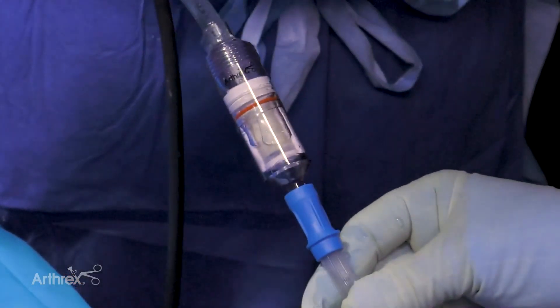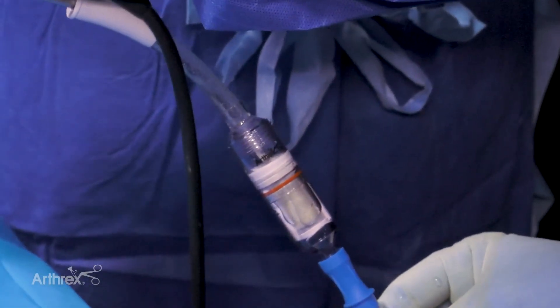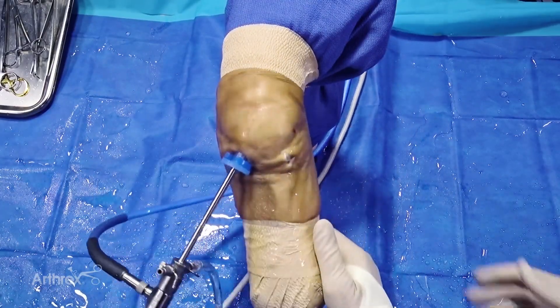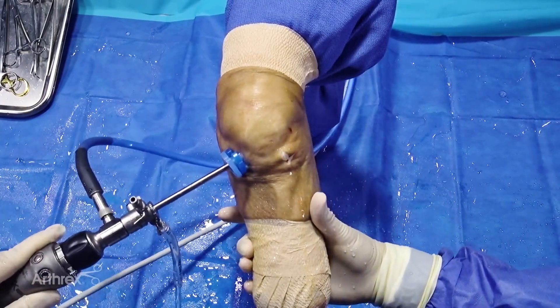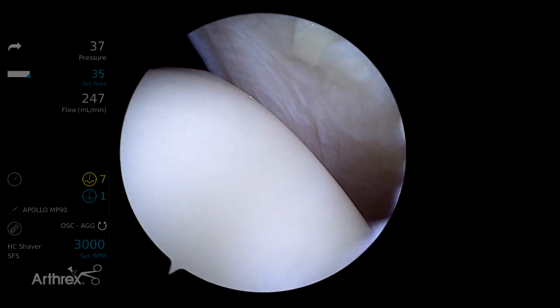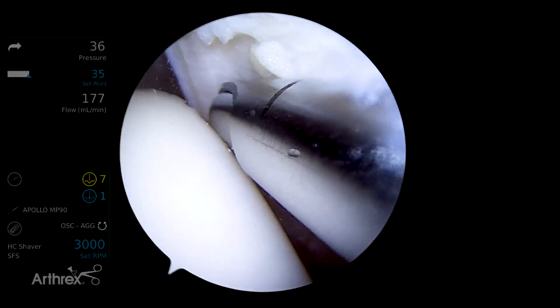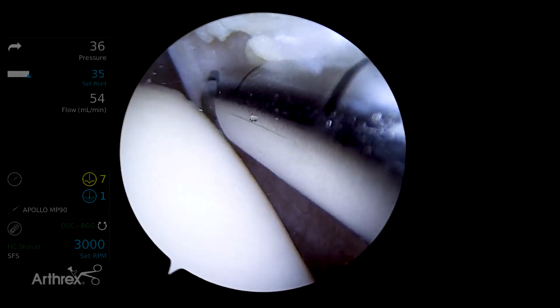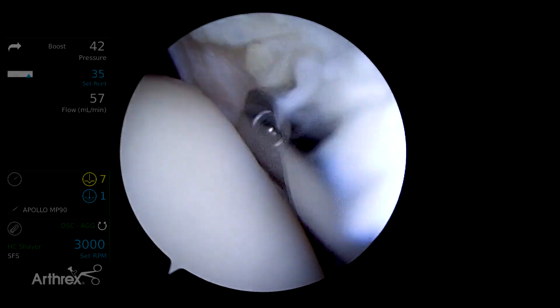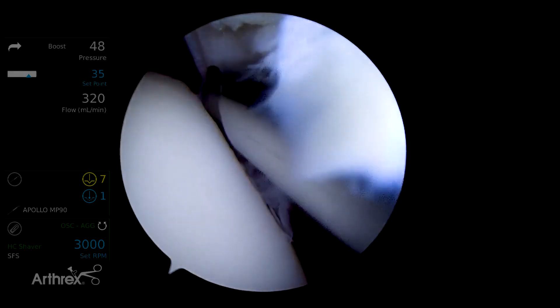We'll come down the far edge. If you want more, we can switch the camera to the inferomedial portal and go up to the lateral trochlear edge to do the same thing — the lateral femoral condyle and lateral trochlear edge are also easy non-weight-bearing harvest sites. All the while, we're accumulating about two to three cc's of articular cartilage as our basis for graft material, which can be combined with something of your choosing — ACP or bone marrow concentrate, for example.